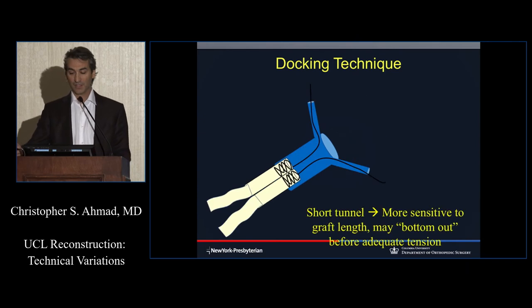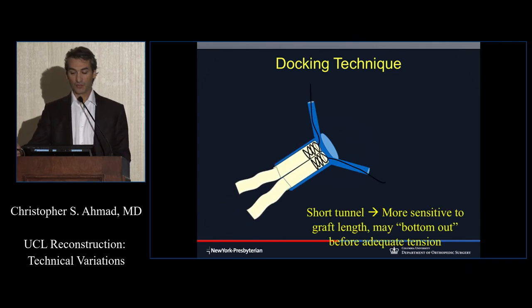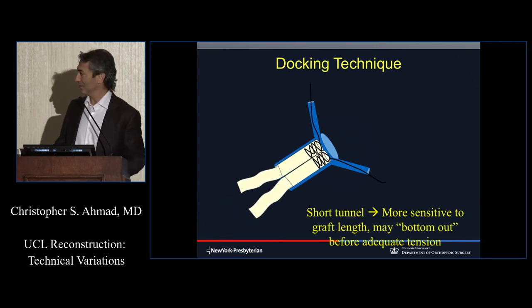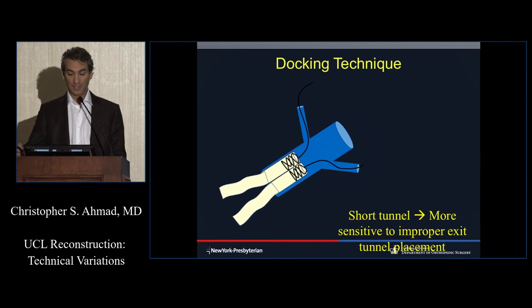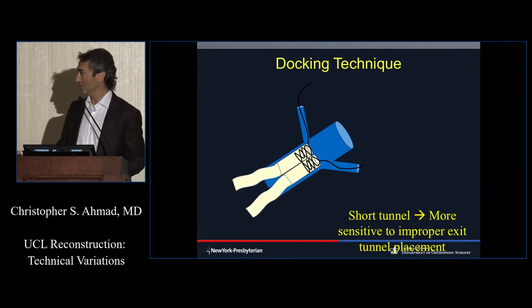Perfect. This is what could happen if you have a short tunnel. Then you don't have a lot of tolerance, and you may get a loose graft, and then it hits the end of the tunnel and the thing's loose. And then what do you do? That's one of my favorite questions to ask a fellow, what do you do now? Because you need a plan on how to deal with that. And even if you have a long tunnel, when you create the exit tunnels, you're actually not seeing inside where the tunnel goes. You may feel like you got this magic tunnel.